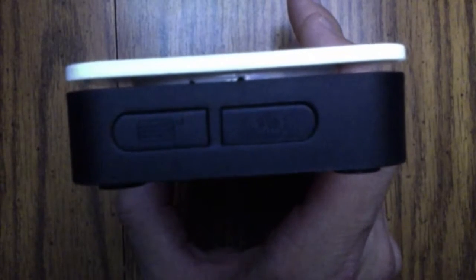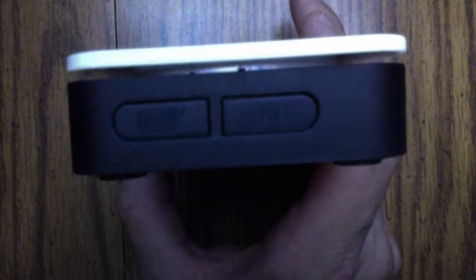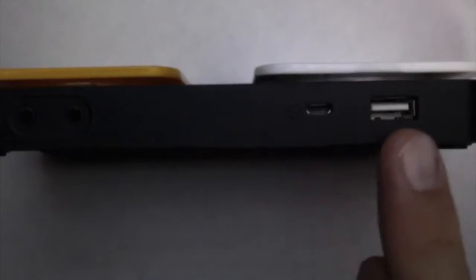This side of the device has the pair button, which is used when you program or pair the device to your iPad. This side of the switch has two charging ports for USB and micro USB that can be charged using a USB on your computer, or they can be plugged into the wall. These two ports are for external switches, so that if a student cannot move their hands close enough to both sides of the switches, you can place switches on different sides of your body.